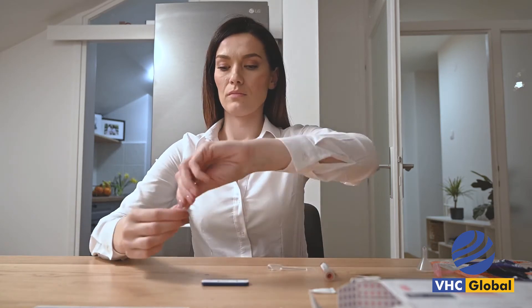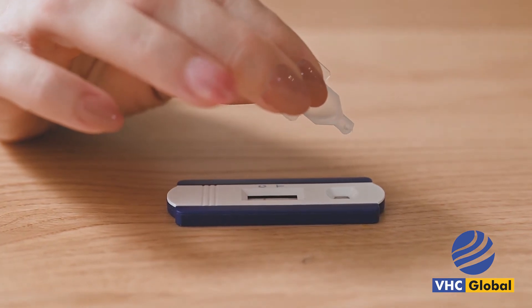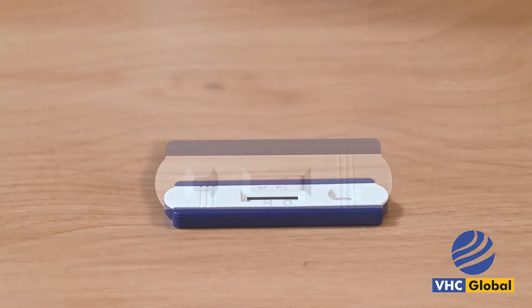3 drops buffer. Now, using the white dropper, tear off the tap cap and add 3 drops of the liquid solution into the same circular hole.